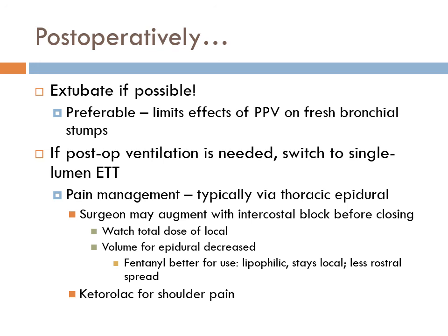You DL. You look at your cords, and you put the bougie pointing anterior because you're gonna feel the cartilaginous rings. You go in. You slip that baby in. It's gonna go right in. Oh, it's a little anterior. You bend your bougie. This is not a good bougie, but you bend your bougie. The blue one's full. You bend it. Oh, I gotta go more anterior. You get it up there. It pops in. Push it past the cords. Feel the rings. If you put this on your fingers here, this is what you'll feel. You'll feel those little bumps. And feel it afterwards. Come down here and feel this. You know you're in the trachea.